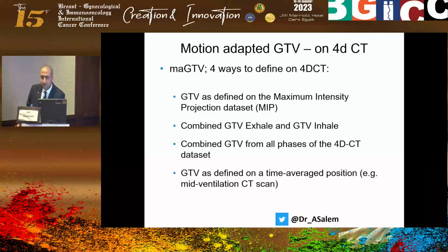We have just a camera on the table of the CT. Then the patient is asked for deep inspiration, then free moving, and we see the level between them. All right. Yeah. Very good. And the new one, Catalyst, but we don't use it now. Catalyst, deep inspiration, but not in our institution. Okay. Thank you very much, Dr. Suha.